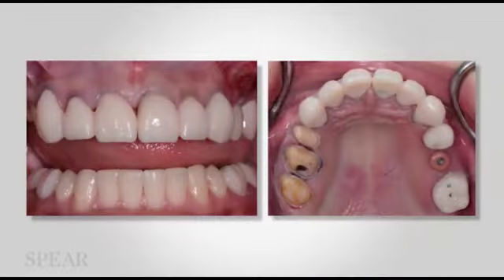And now I can cement the anterior provisionals at this point, and you see where they are right now. Now, I want to share something with you because you're looking at those right now going, interesting, Kev, what's up with that funky diastema and that sort of canted? And I was thinking the same thing. I'm like, how did that happen? And you know what's interesting is, I look at that wax up again, and that wax up has those exact same contours on the model.